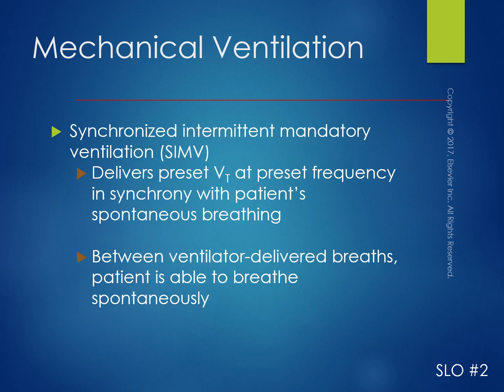So our next ventilator mode is synchronized intermittent mandatory ventilation, so SIMV. This delivers a preset tidal volume at a preset frequency, similar to the ACV, in synchrony with the patient's breathing. However, when the patient does take spontaneous breaths on their own, which they're allowed to do, they're kind of on their own. The ventilator is not going to provide any support. So with those additional breaths, the patient's going to determine the inspiratory flow rate and time, the tidal volume, and the inspiratory to expiratory ratio. That's all on the patient. So any additional breaths go unsupported.